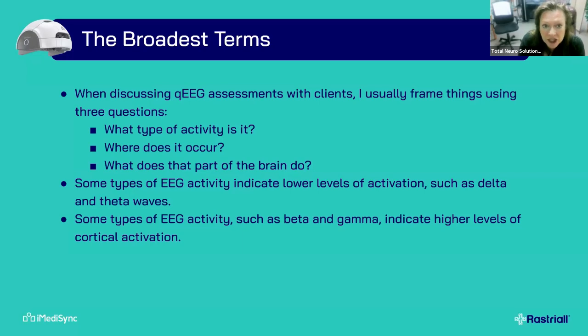So by looking at the EEG, we can narrow down where the problem is coming from. He was talking about the one that he showed on the spectral that had the little Charlie Brown head on it. And because it had alpha in the front skewed to left, it is a good guess to say that there is negative rumination and depression there. So that's one way the clinical utility of the EEG can help us match and confirm diagnosis and match what's going on in the brain with the client's symptoms.